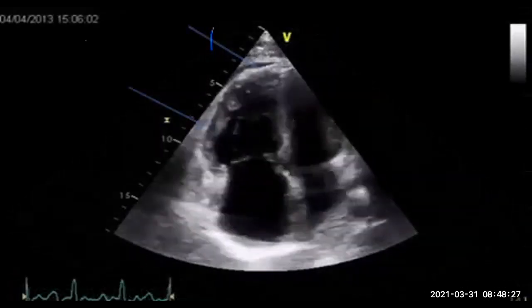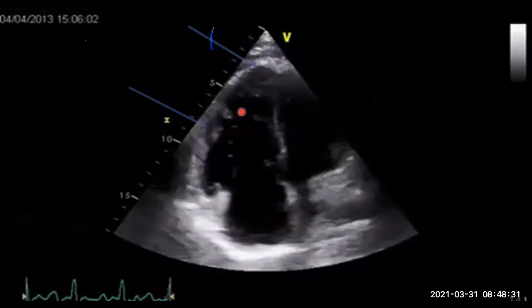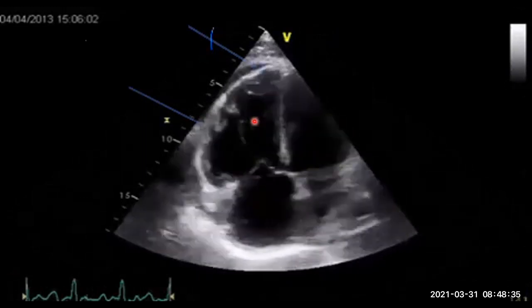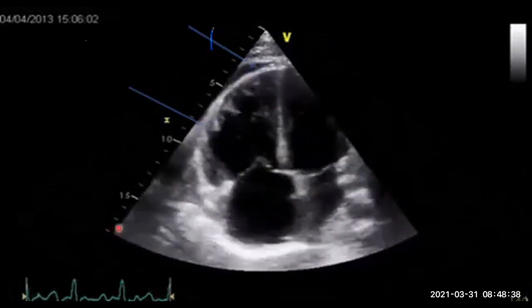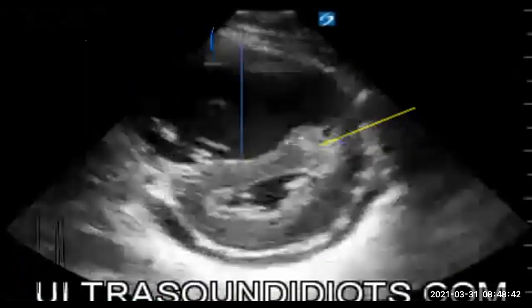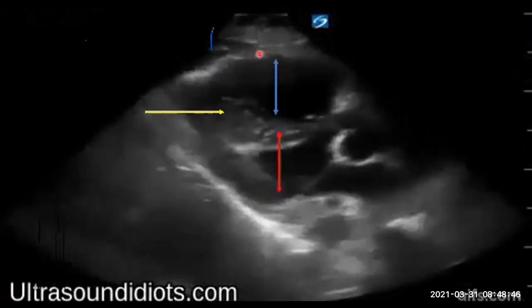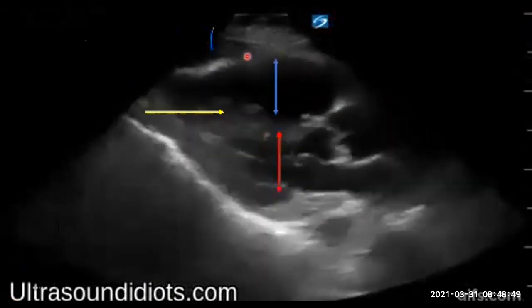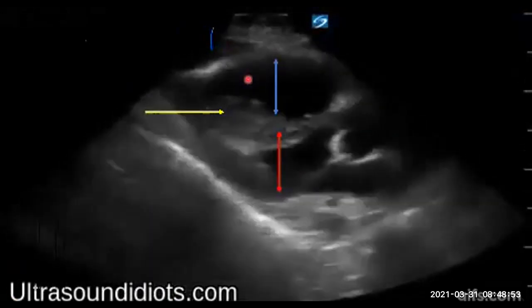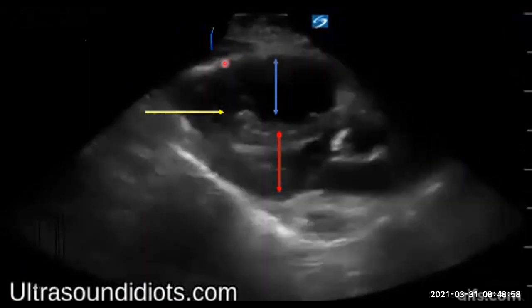Number one, a lot of the signs that are happening here are in the acute stage. All right. And with COPD and COAD patients, whatever you want to call it, they have a more chronic course. Let me get it back to this one, sorry, one second. So in the acute phase, you'll notice, number one, this wall is not hypertrophied. It's just stretched. So what you would expect with a patient with COPD is that over time, the right ventricle would have adjusted to it. So you start getting more of a hypertrophied ventricle.